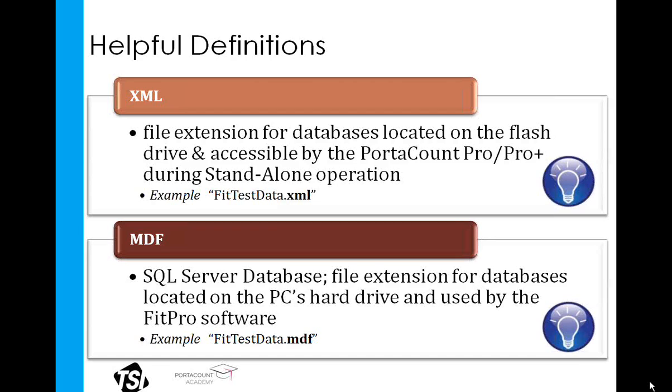The important thing to take away from this slide is that the XML database is the database that is located on your flash drive, while the MDF database is the database that the FitPro software on your computer will use. Again, these terms are not specific to just this software package. These database configurations are used by many other software packages as well.